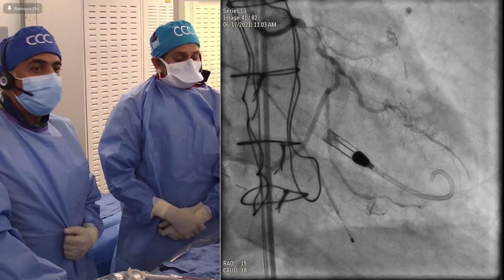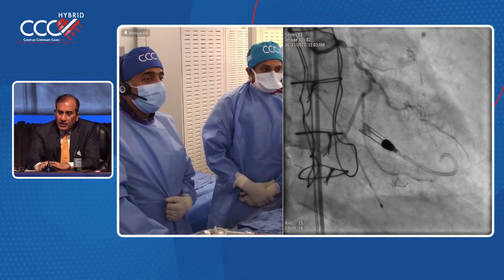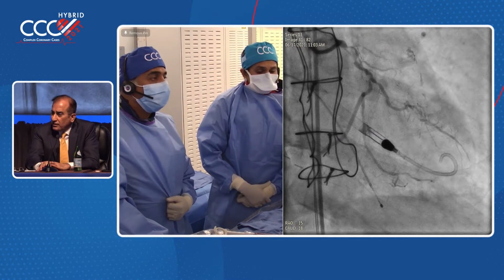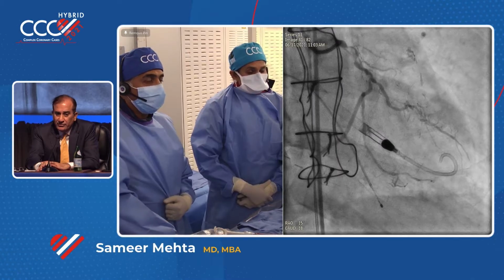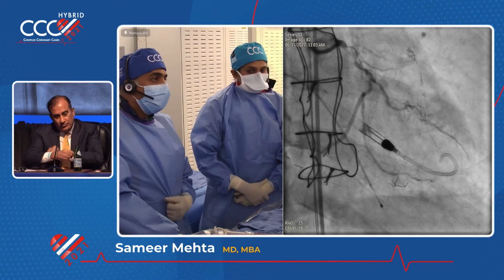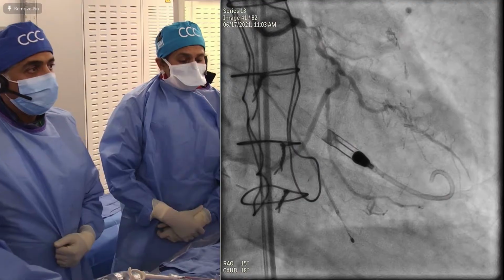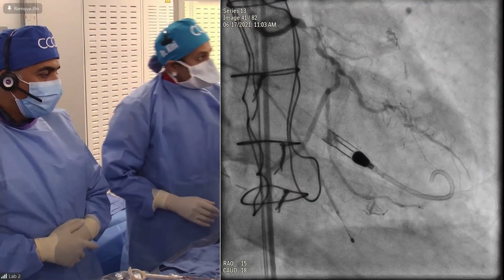Can you speak into the mic because we can't hear you? Probably a run-through wire, then exchange it for a rota, probably starting with the 1.5 burr and expanding with the second burr. Wow, I get scared with a 1.5 burr. I don't know. What do you all think? Like 1.25, 1.5? It's very severe. But I think wiring is very challenging in this case.